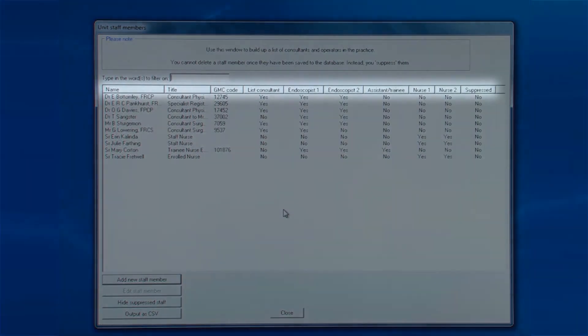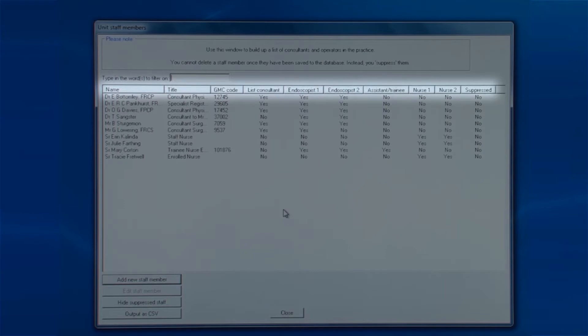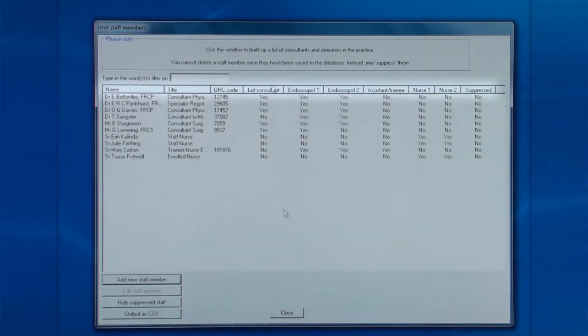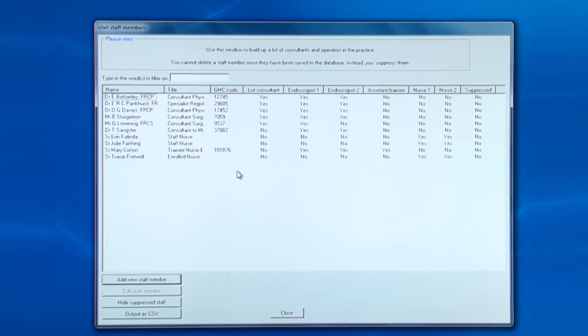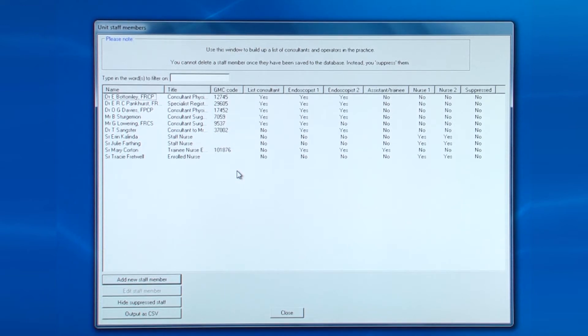As with previous screens, you can sort the columns alphabetically by clicking on the column names. Because this is the NED compliant version, GMC numbers are obligatory for all endoscopists and NMC numbers for nurse endoscopists. Above the column headings is a box that allows you to search for names in the list.